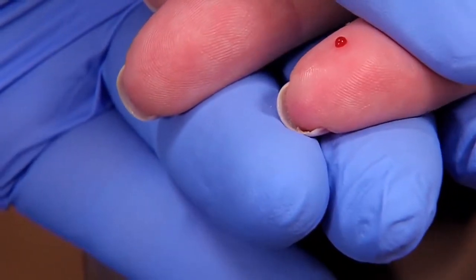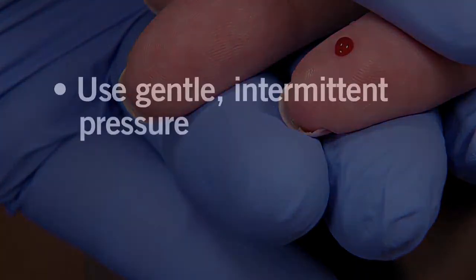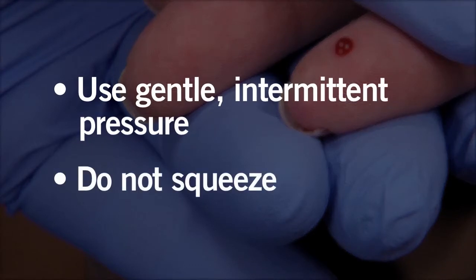Apply gentle pressure, let up, then reapply the pressure. This intermittent pressure helps the blood flow freely. Don't squeeze too hard. Forceful squeezing frees fluid that dilutes the blood, causing inaccurate results.